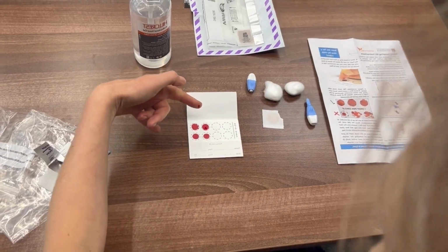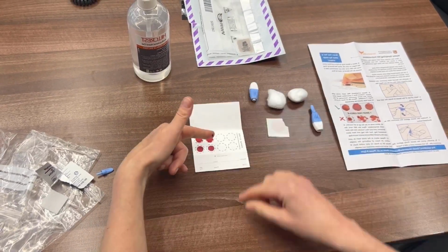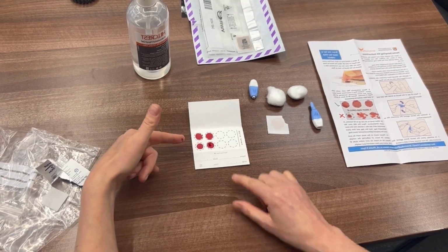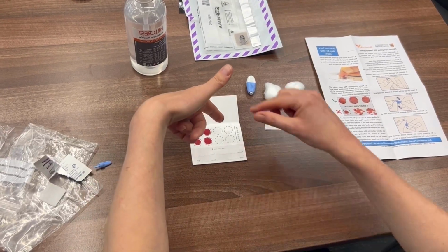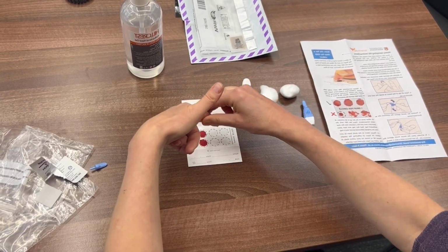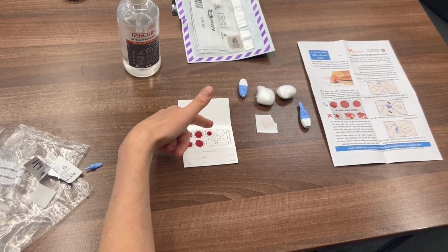So you can see my spots are coming together nicely now. This one's a little bit short. I haven't quite made the circumference, so I'm just filling that one up again. And so this whole process can just take a few minutes whilst we rely on blood flow.